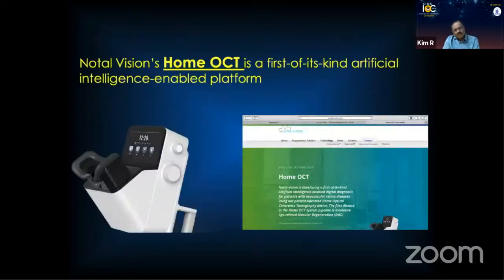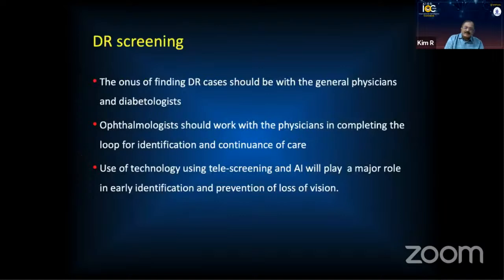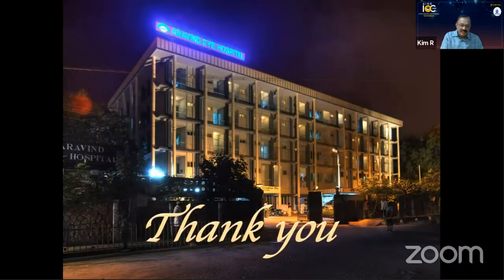With home OCTs and different technology developing, we will find much easier ways to reach these diabetic patients early on before they lose their vision. So as I said earlier, the onus of finding the DR cases should be with the diabetologists and physicians, and ophthalmologists should work with them. Using this technology will play a major role in early identification and preventing the loss of vision.